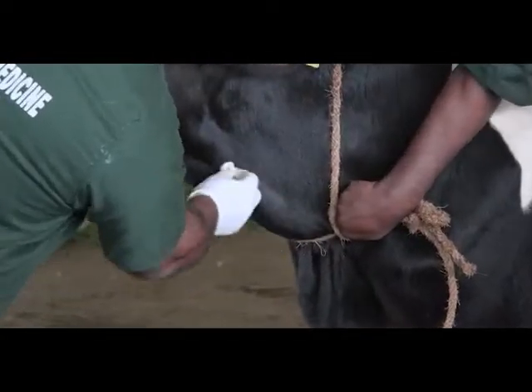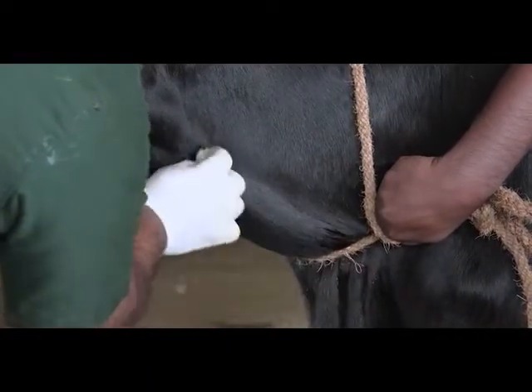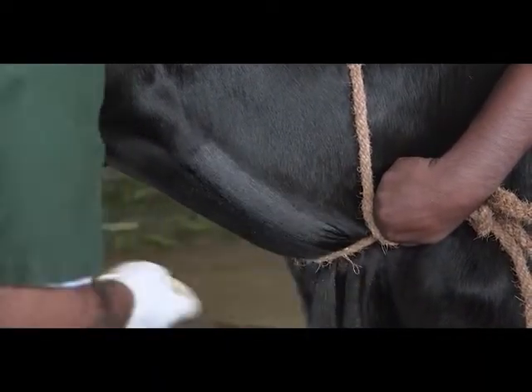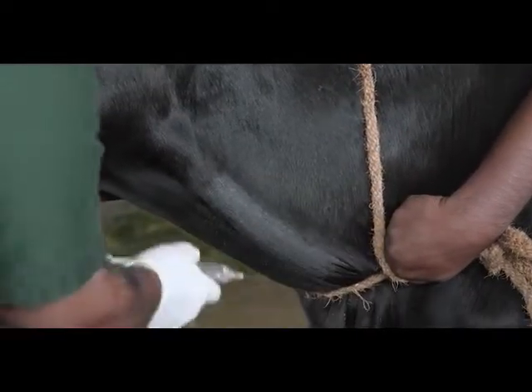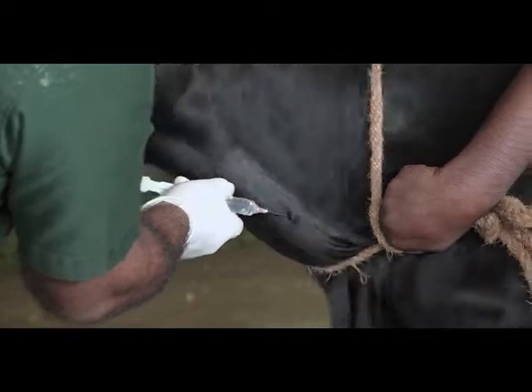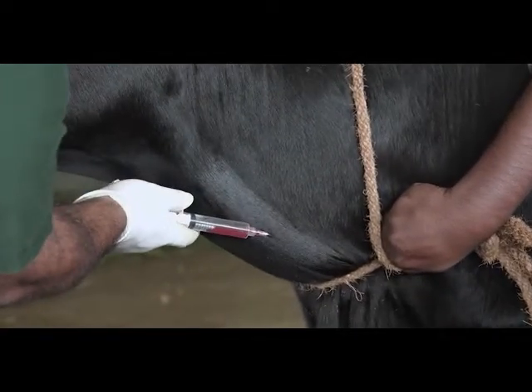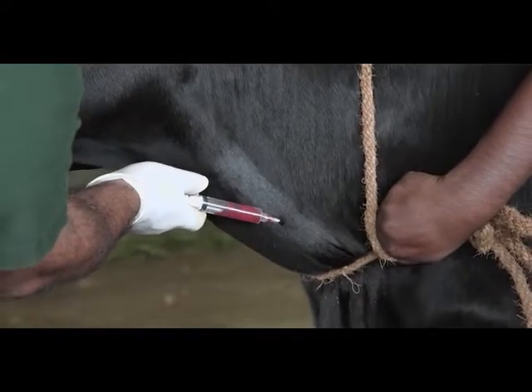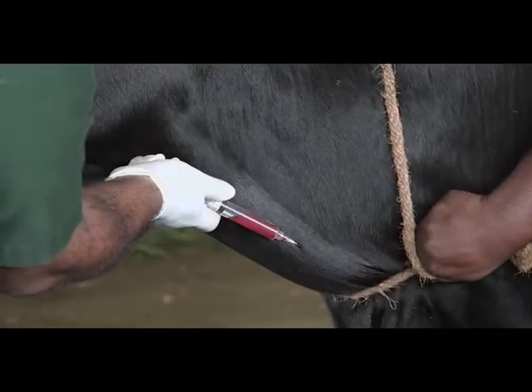Then you may disinfect the area. Then pierce the skin and the vein at a 45 degree angle to the surface as demonstrated. Pull the plunger back to see whether blood is coming into the syringe, in order to make sure the needle is inside the vein if necessary.